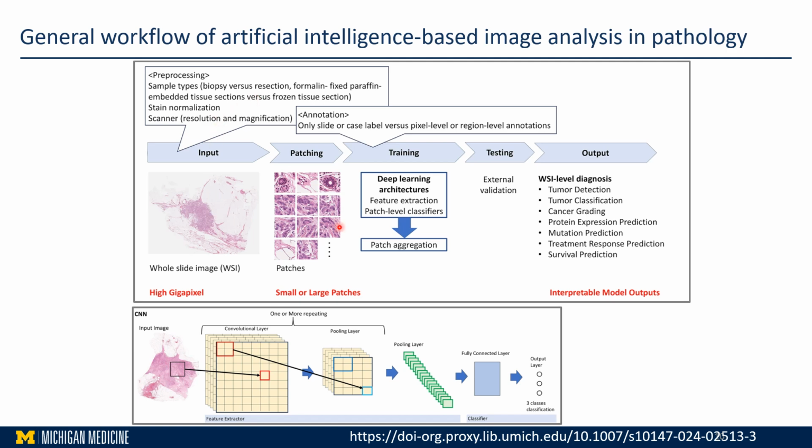And then all these images, after they are generated, maybe they are divided into patches, and then processed through various deep learning architectures, which meticulously learn and extract intricate features from smaller image patches.